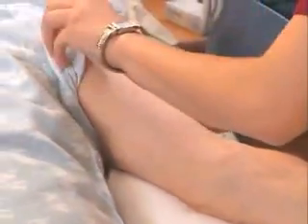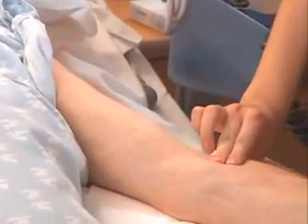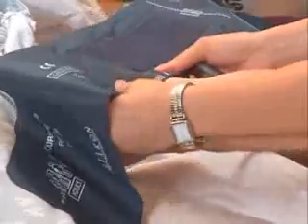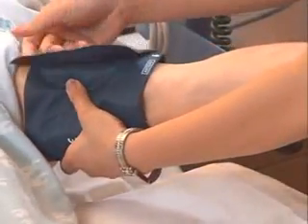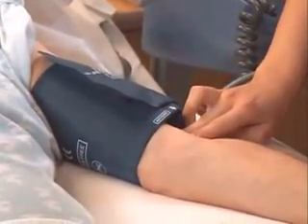Okay. Now, Rose, can you describe what you're doing? Well, first I'll palpate for the brachial artery. Okay. And I'll center the bladder of the cuff over the artery, lining up the mark on the cuff with the artery in the limb. There we go. Okay, just remember when using an automatic blood pressure device for serial readings, check the cuff limb frequently. That's to make sure the cuff deflates between readings, right?